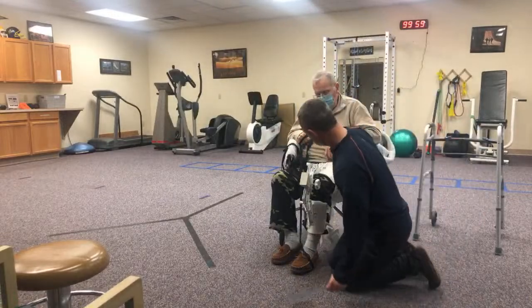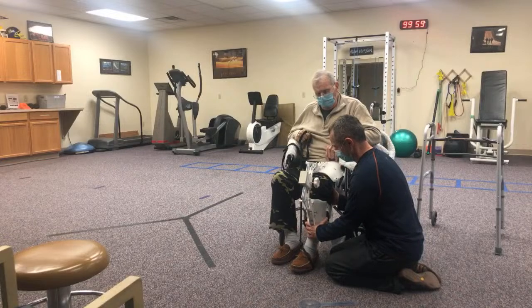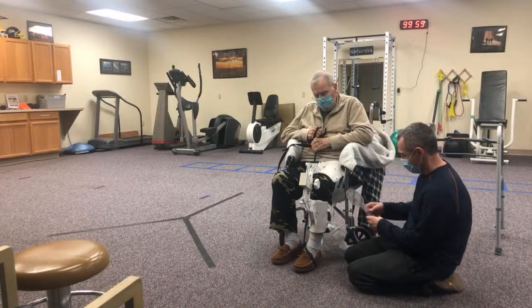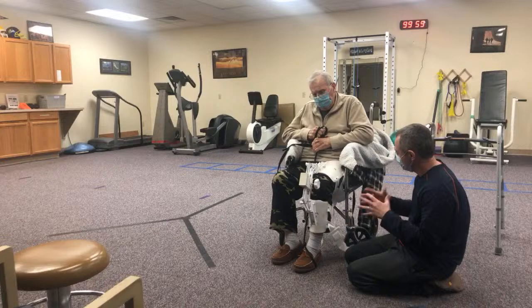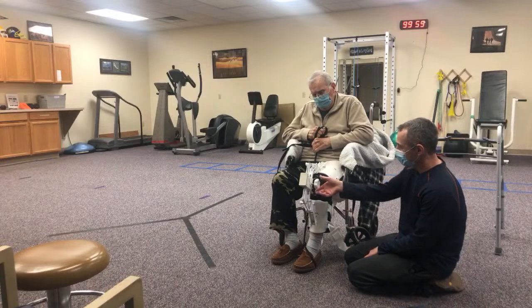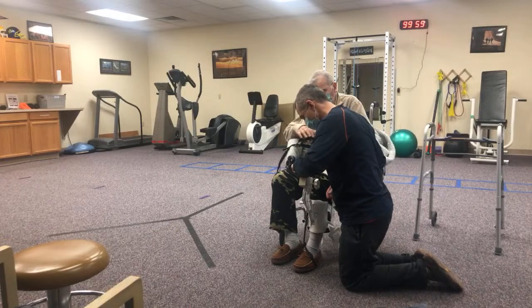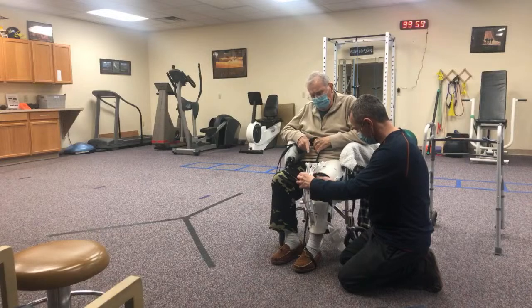I want to get one more measurement - this will be the last one. Let's lift it and you just do your best to relax. Right there we're at 81 degrees. I'm going to take the pressure off - if I go with the top number it's at 2, so we'll use that for reference. I'm going to move my foot out just a little bit.